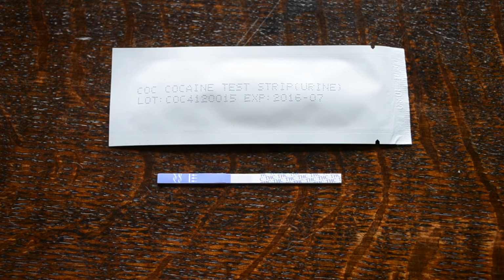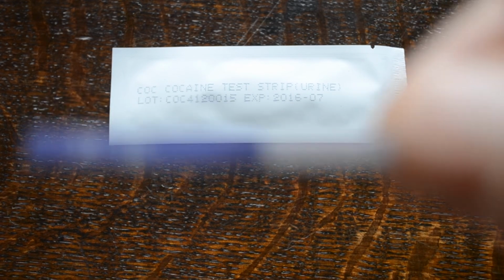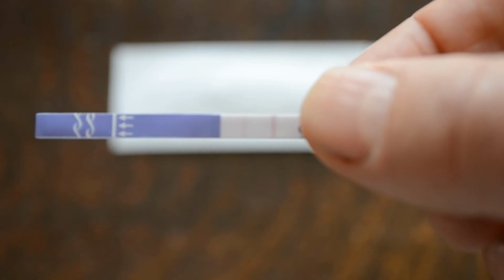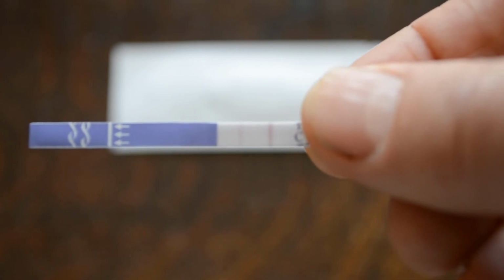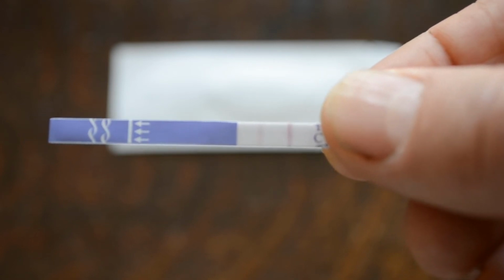And then what we're looking for is the development of a control and test line. Now, the control line will always form nearest the handle end, and the test line, which is how you interpret the results as to whether it's present or absent, will form nearest the dipped end. If I bring this closer to the camera and attain a focus on it for you, okay, you can see there in this central flattened portion of the test strip two lines forming. The one nearest my finger is the control line, and the one that you're interpreting the result on is that test line which is formed nearest the dip end.